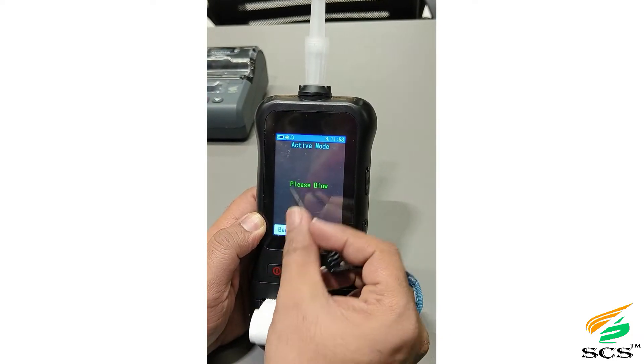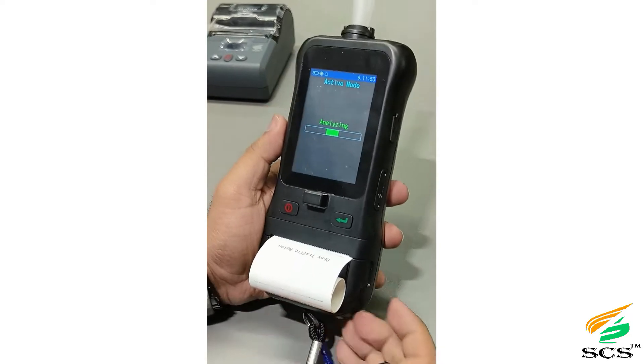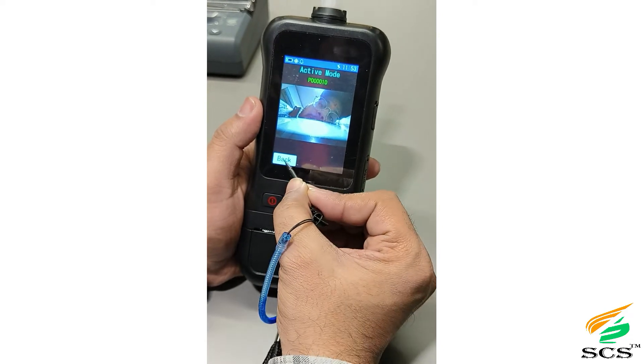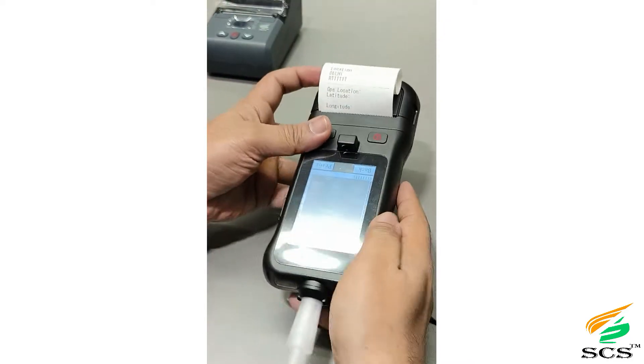Now we demonstrate the active blowing test. As you blow into the device, it starts analyzing. All the details have to be filled in. If you want a photo, click on Capture and the picture will appear. Then click Print — the print will come out with the photo.